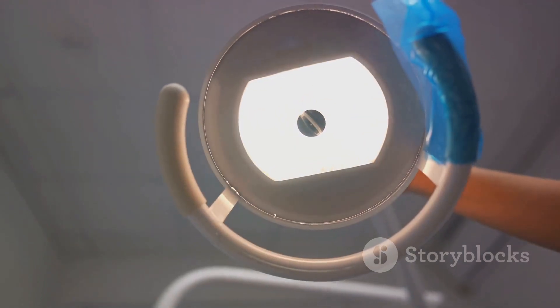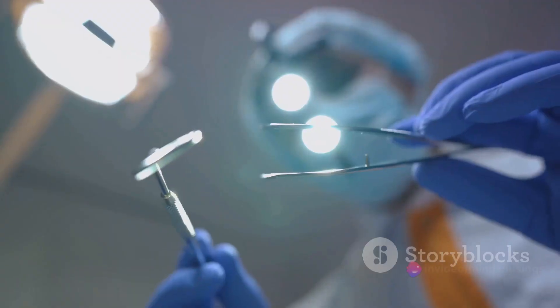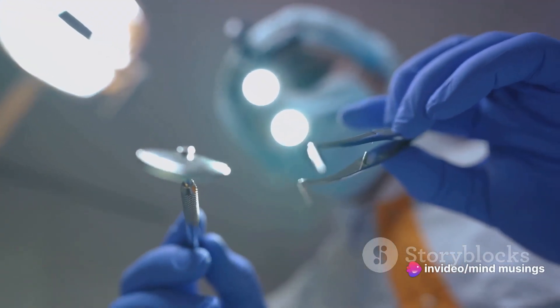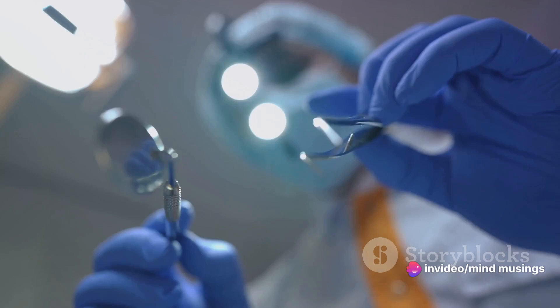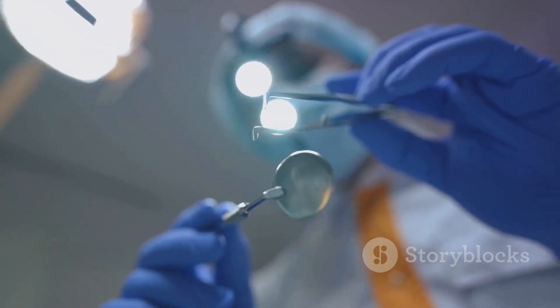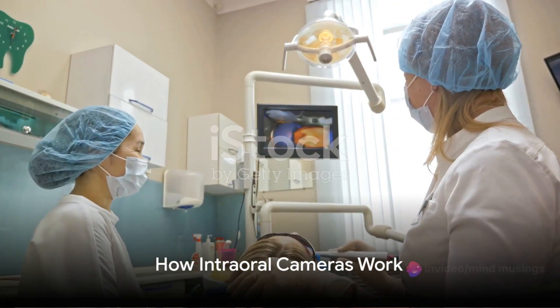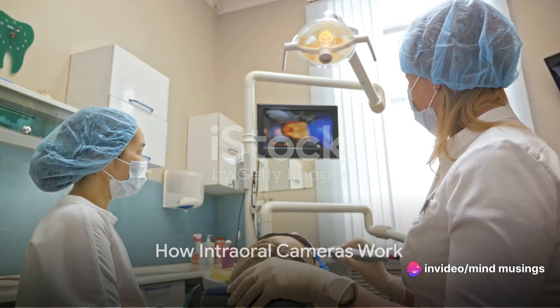The magic lies in the tiny lens at the tip of the camera, which captures intricate details often missed by the naked eye. This technology provides an unparalleled view of the oral cavity, making it easier for your dentist to identify potential issues like cavities, gum disease, or oral cancer at early stages.